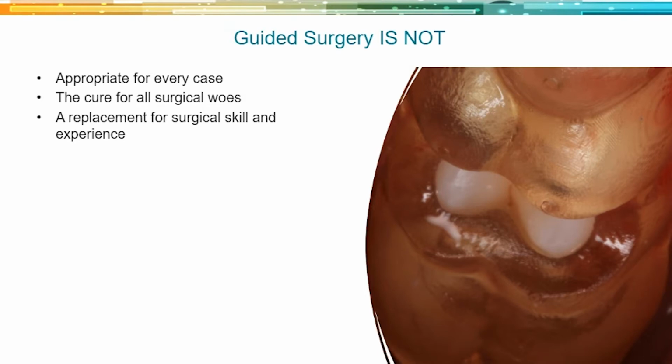You don't want to get so comfortable or reliant on a guide that if something goes wrong, you're suddenly out of depth. Okay, it's not foolproof. Things can go wrong. Things have certainly gone wrong in my hands, and I've seen it go wrong in others' hands. We'll talk about some of those examples. I said that it's more accurate than freehand, but look at the lit. There's still a couple tenths of millimeters that we're going to have some leeway and some give.